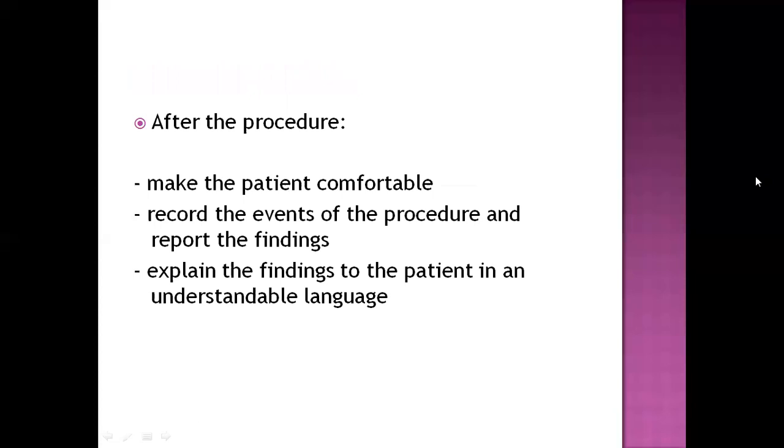After the procedure, the nurse first of all makes the patient comfortable, records all the events during the procedure, starting from the beginning till the end, and makes a report about findings of that procedure. Again, nurse explains the findings to the patient in an understandable language so that patient can comprehend about his or her condition.